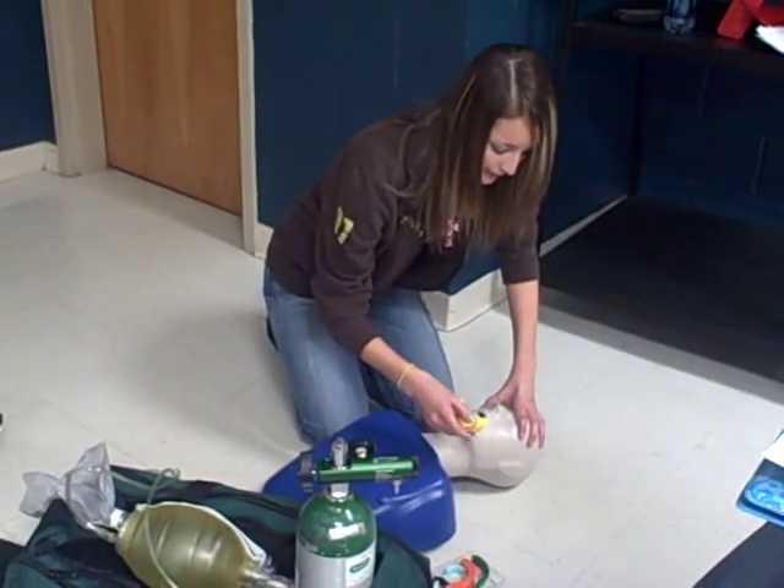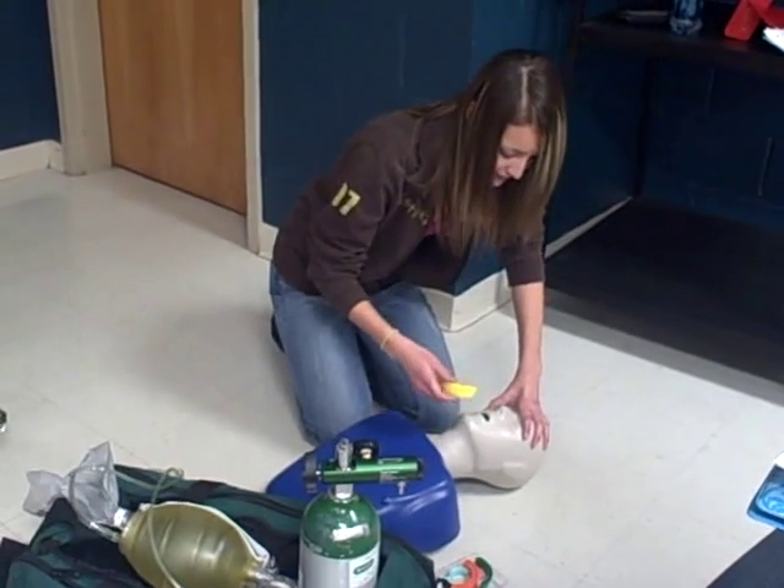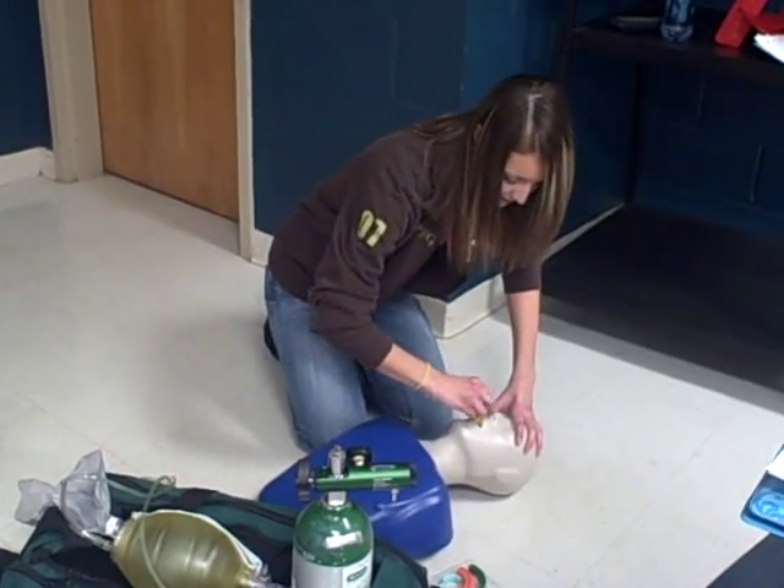Here's the airway adjunct. We'll measure from the corner of his mouth to his ear. This one's proper. We'll go ahead and insert the airway.